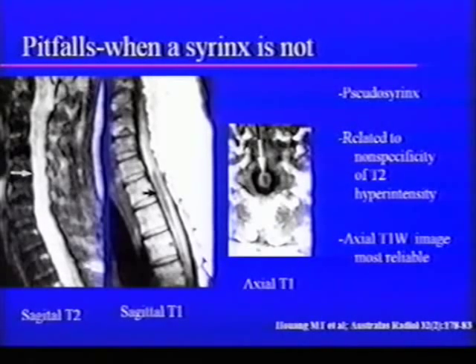The last pitfall is one of the things that portends not as good an outcome, if you have a cystic cavity in the spinal cord. One of the challenges is diagnosing when you have a cystic cavity in the spinal cord. What some people will do is they will say, I know that the T2 sequence shows me fluid. So if I see a spinal cord and I see bright in there, that's fluid, that's a syrinx. There's a cystic cavity. I just want to emphasize that the T2 shows you all of those different things that are bright. Sclerosis, remyelination, demyelination, tumor.